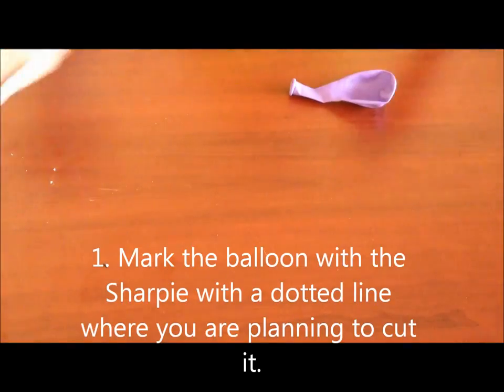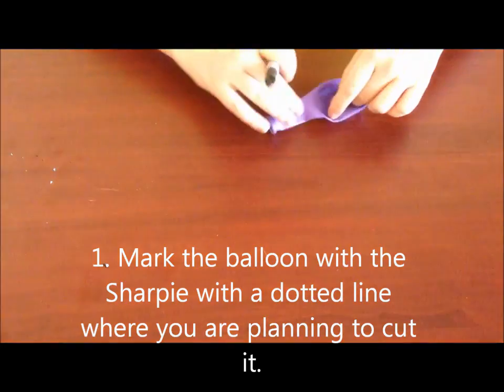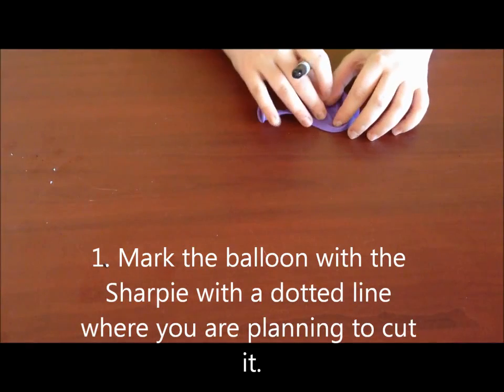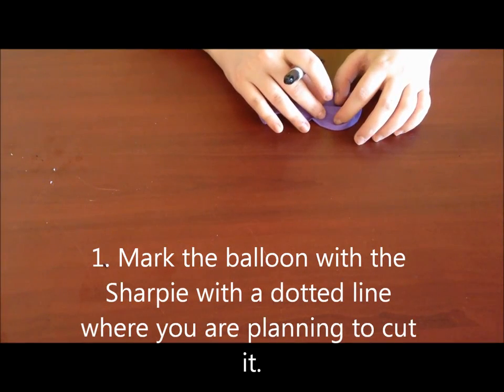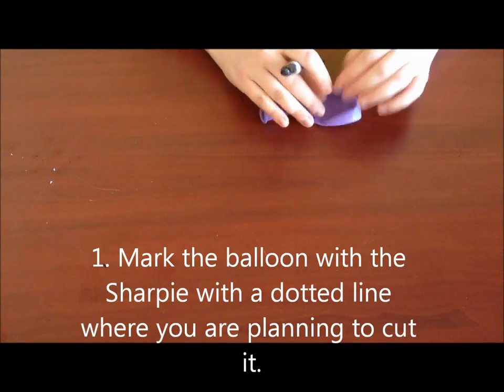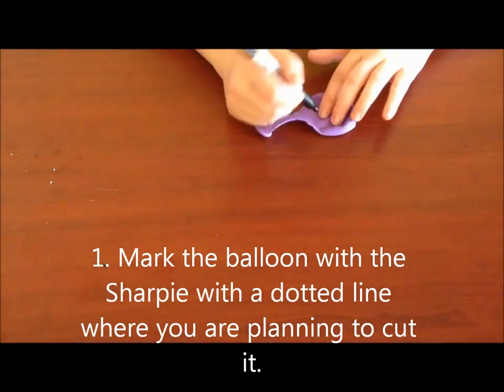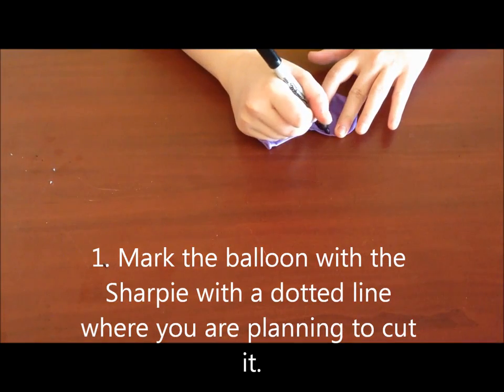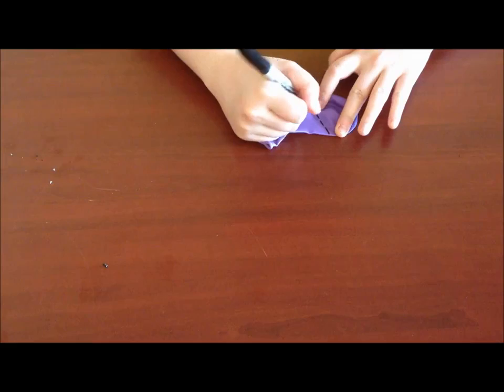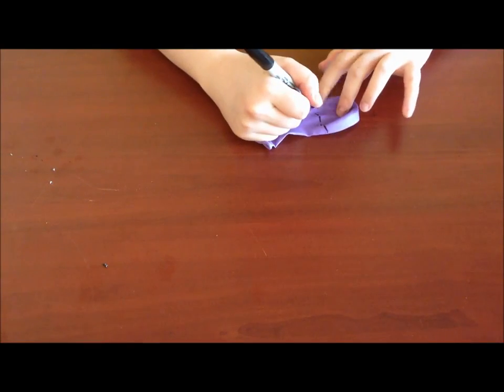The first thing we're going to do is mark our balloon where we're going to want to cut it. The easiest way to do it is to think about - you want it to be thinner on the bottom than it is on the top, but you don't want it to be so thin it won't fit around the funnel. I usually like to mark it right about here on the balloon, just give it a little dotted line so I know to cut right there.